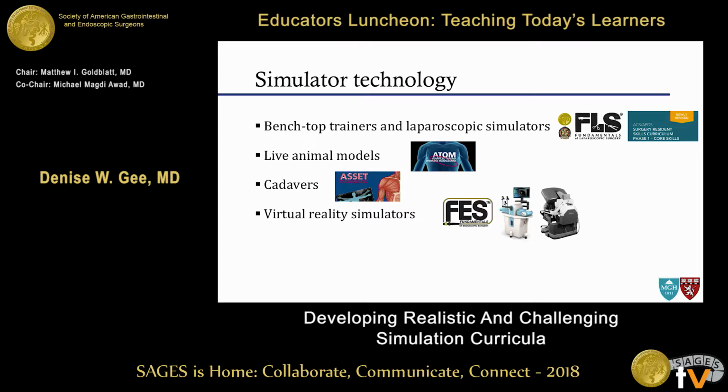And these potentially can be high fidelity, and they are reusable, and many different trainees can use them. But again, they can have lack of force feedback. They can be expensive. And some models may have limited realism in the sense that just because they have a simulated lap chole doesn't mean it's like the actual operation.